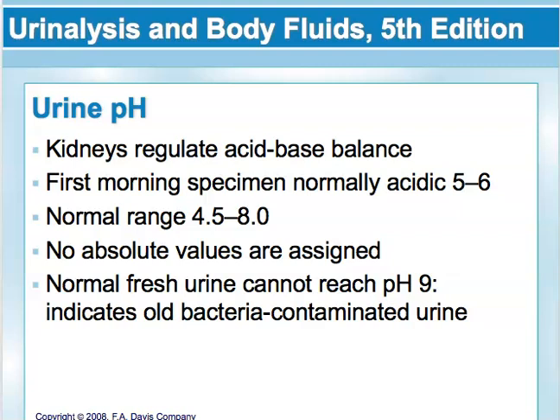In lecture 2, we're going to start talking about the different tests that are on the chemical reagent strip that we use to perform the urinalysis. So in this lecture, we will get through ketones. We'll stop at the end of ketones and pick up in lecture 3 at blood.